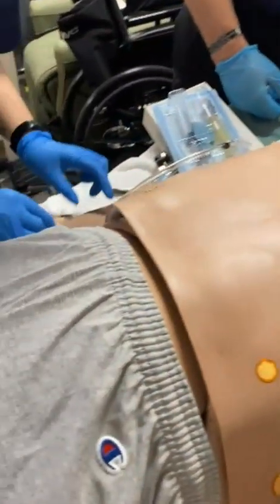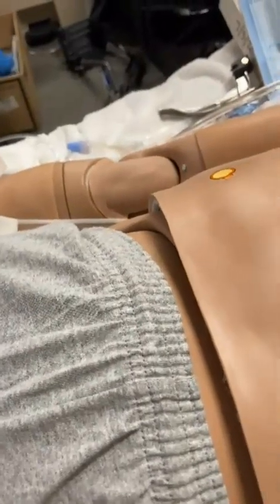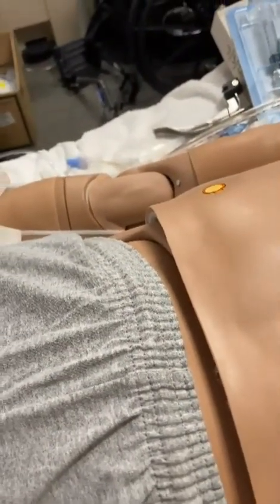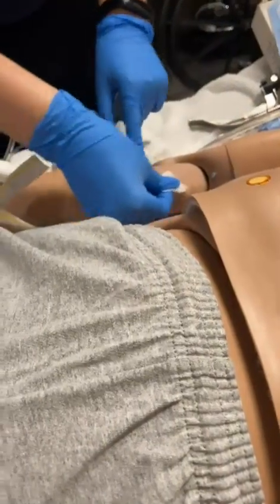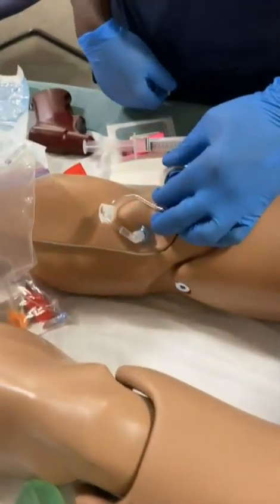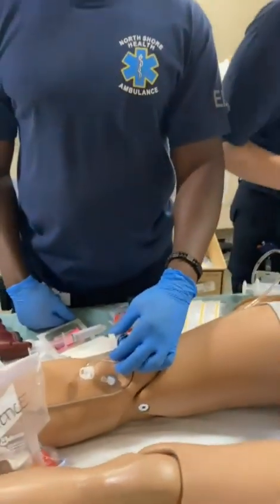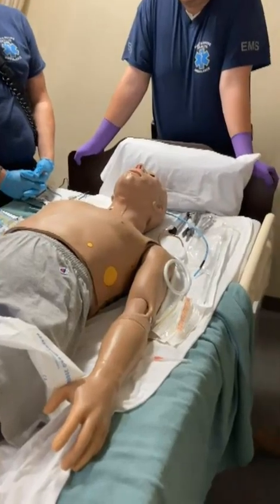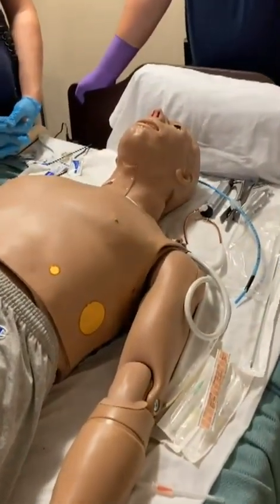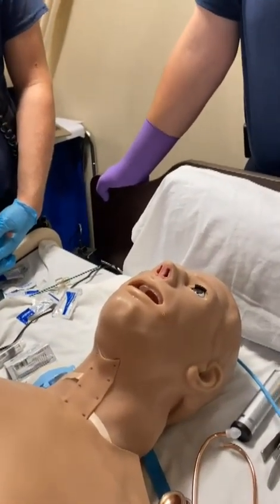This patient is eventually going to go apneic, but right now we're just trying to secure his airway because at some point we won't be able to secure it with any kind of longevity. IO is in and we're working on a second access port for IV. In real life we'd probably do bilateral IVs or an IO depending on how gone he is. The IO went in clean. In normal circumstances you would secure it and keep pressure or put fluids on it if needed. Calen is going to secure an IV, and Josh is in charge of intubation with his partner.